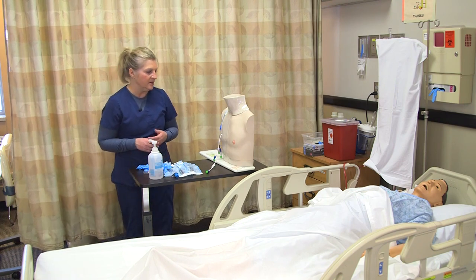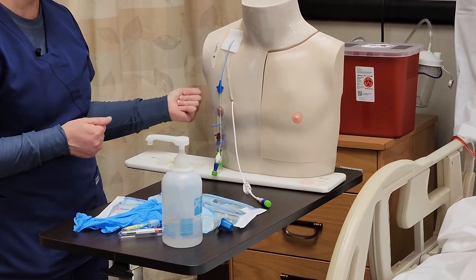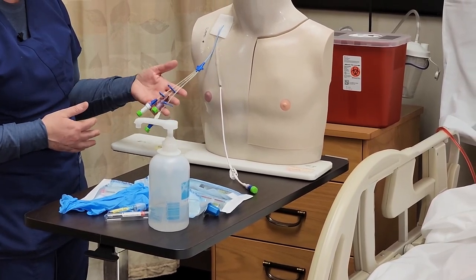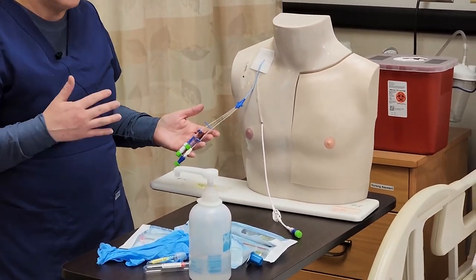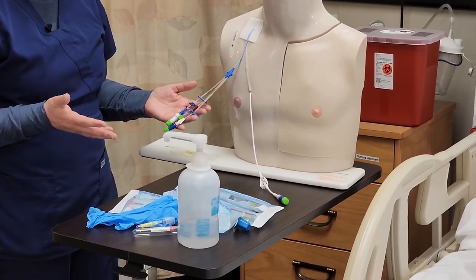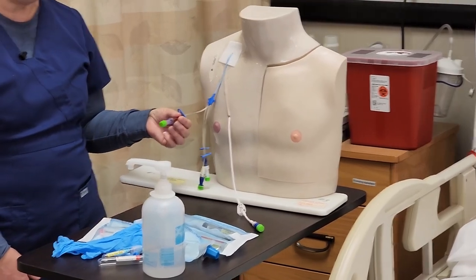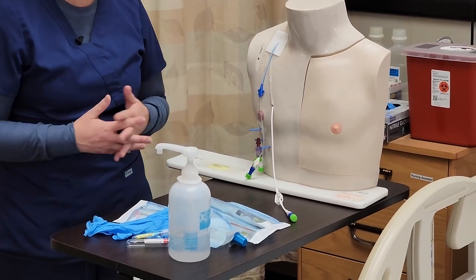Here I'm in my patient's room and I'm looking at the central venous access device. This patient has a triple lumen device, so you can see there are three lumens, and I don't have any IV fluids infusing, so I don't have to worry about stopping or pausing any infusions. I'm going to use the distal port for my blood draw because that is the largest lumen port, which is typically recommended.